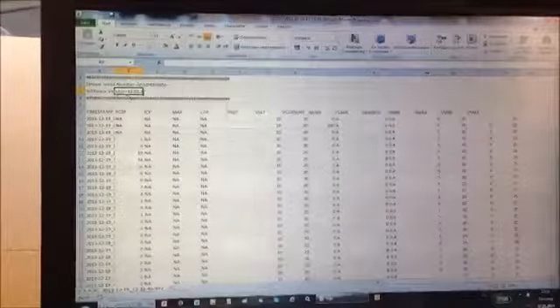When we go back, we open the log file, for example this one, with Microsoft Excel, we directly see the ID of the machine, the software version. If you had entered the patient's name, you would see the patient's name here too.